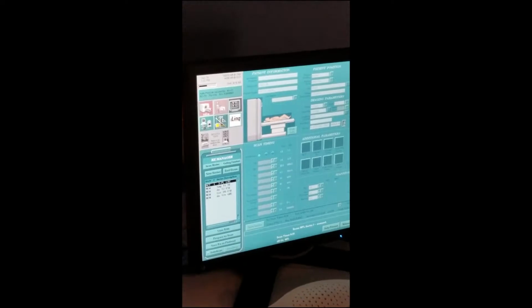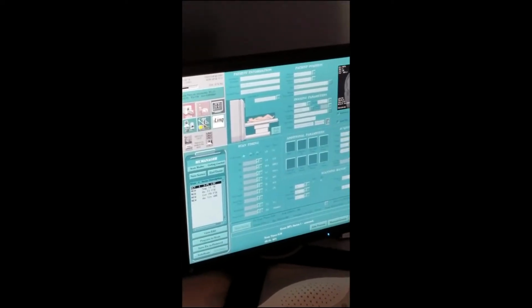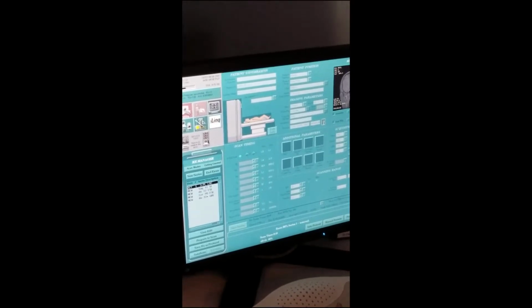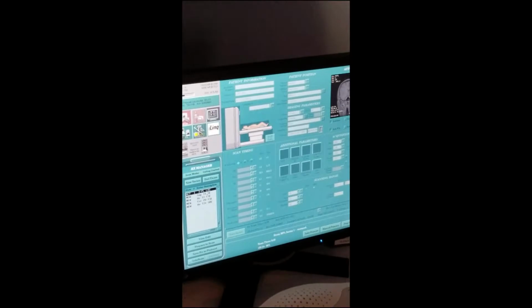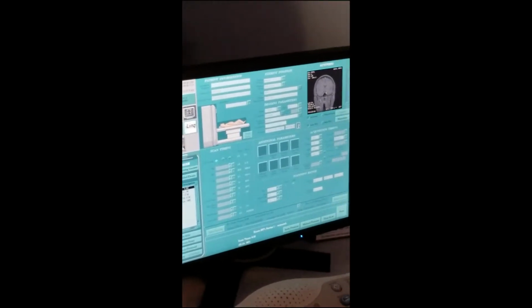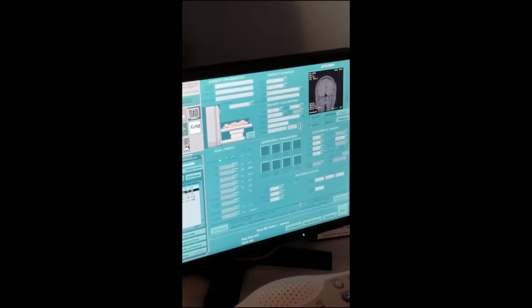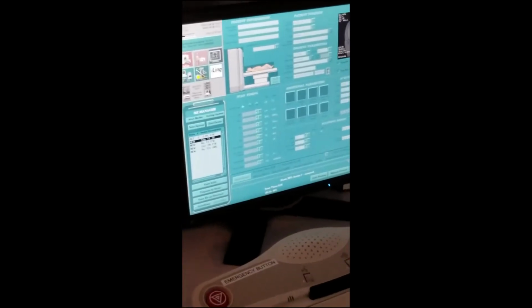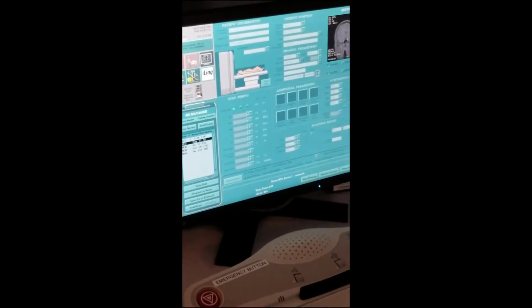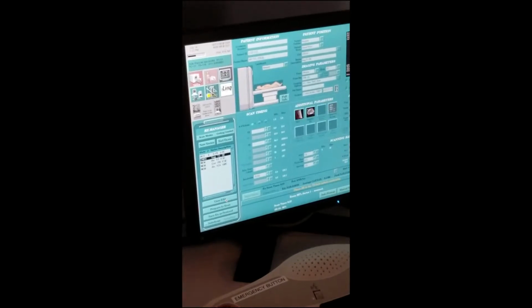Those are gradients that we haven't talked about yet. The gradients are at work to give us the anatomical plane that we want. Sagittal, coronal, and axial. You heard the pitch change, right? Because there is no camera, nothing moves. Remember, something has got to do that. It's gradients, but you learned that in the class, not from me, not today.